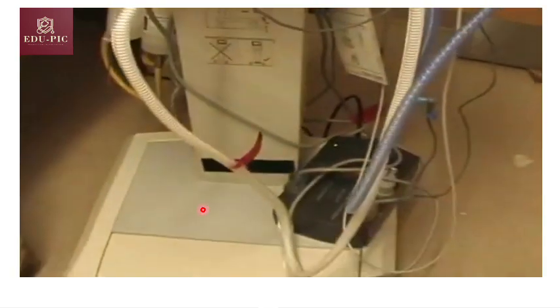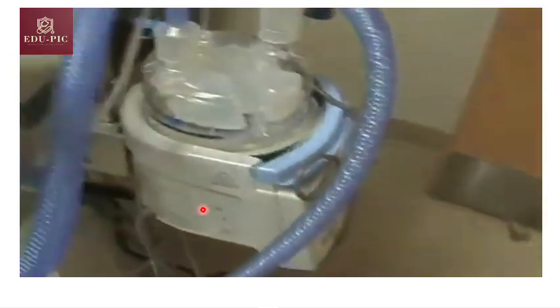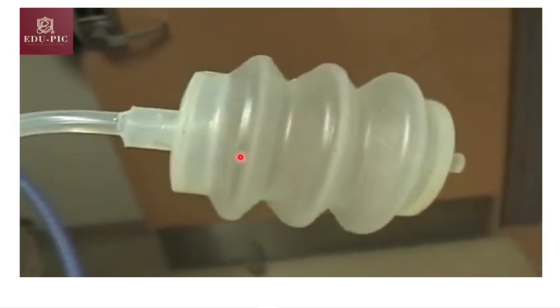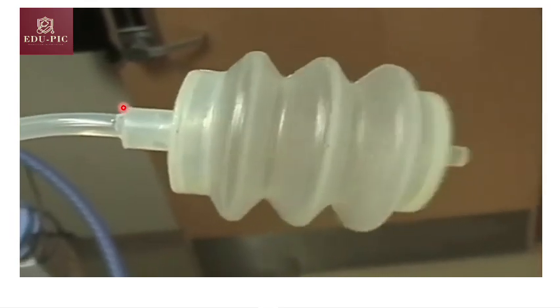Now let's see the traditional or conventional ventilation. This is a baby log machine, and see how much pressure will be delivered to this test lung in comparison to the high frequency oscillatory ventilation. Look here for the test lung, how much pressure is going to this lung.